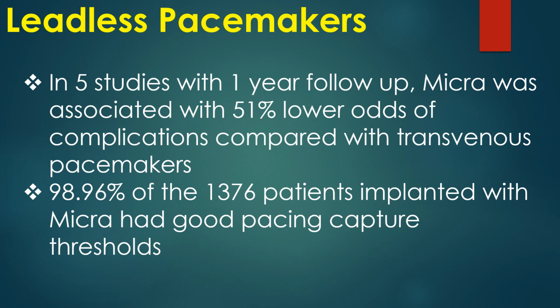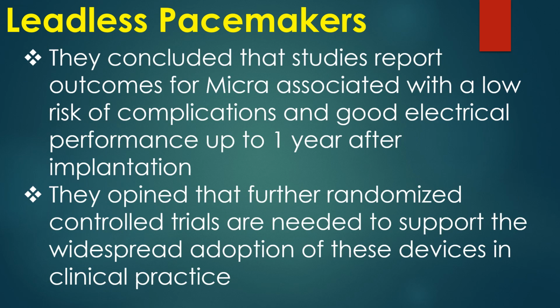98.96% of the 1,376 patients implanted with Micra had good pacing capture thresholds. They concluded that studies report outcomes for Micra associated with a low risk of complications and good electrical performance up to 1 year after implantation. They opined that further randomized controlled trials are needed to support the widespread adoption of these devices in clinical practice.